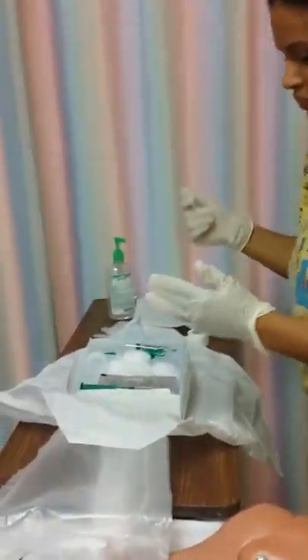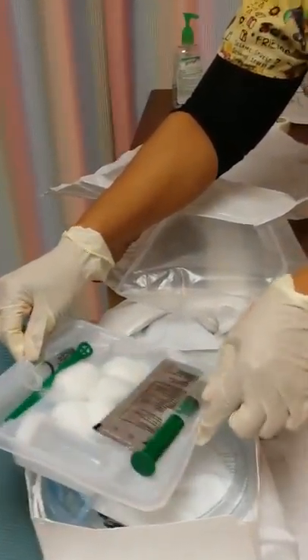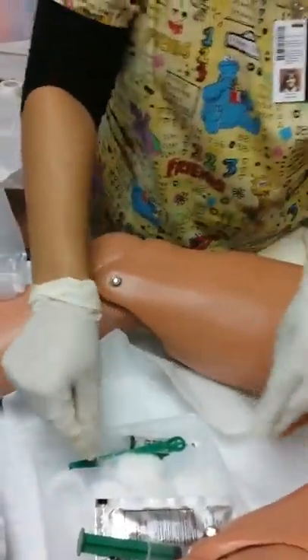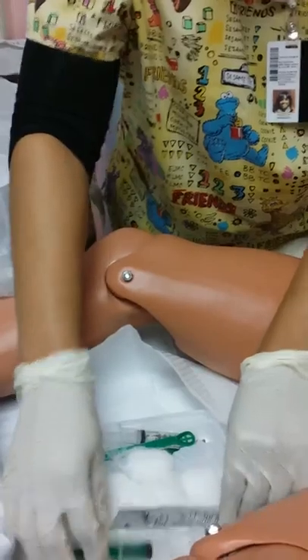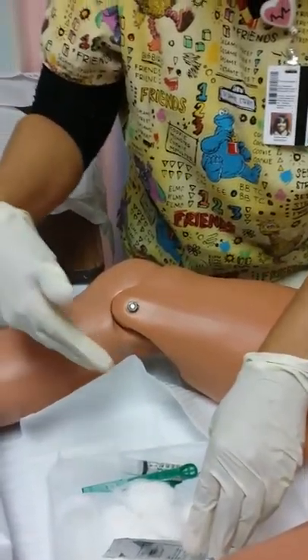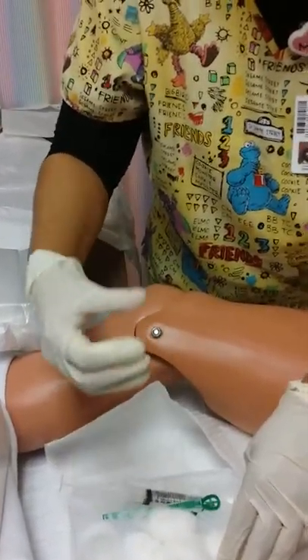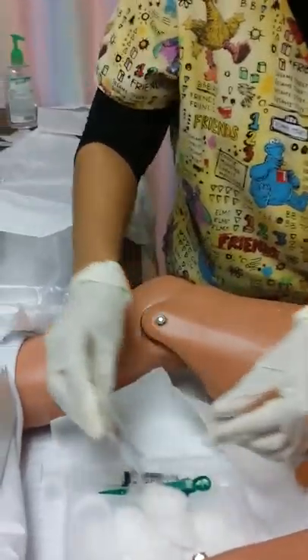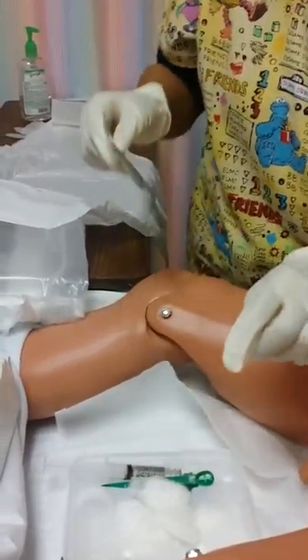Let me get rid of that, and then I'll set up everything, setting that there, setting this here. Okay, so we've got the iodine, which I'm going to use for cleaning. We've got my lubrication, to lubricate the catheter tubing as it goes into the penis, and then we have our solution for the balloon to secure the catheter. I'll get everything prepared and put my iodine on my cotton balls, what I'm going to use to clean the meatus, then I'll get rid of that.